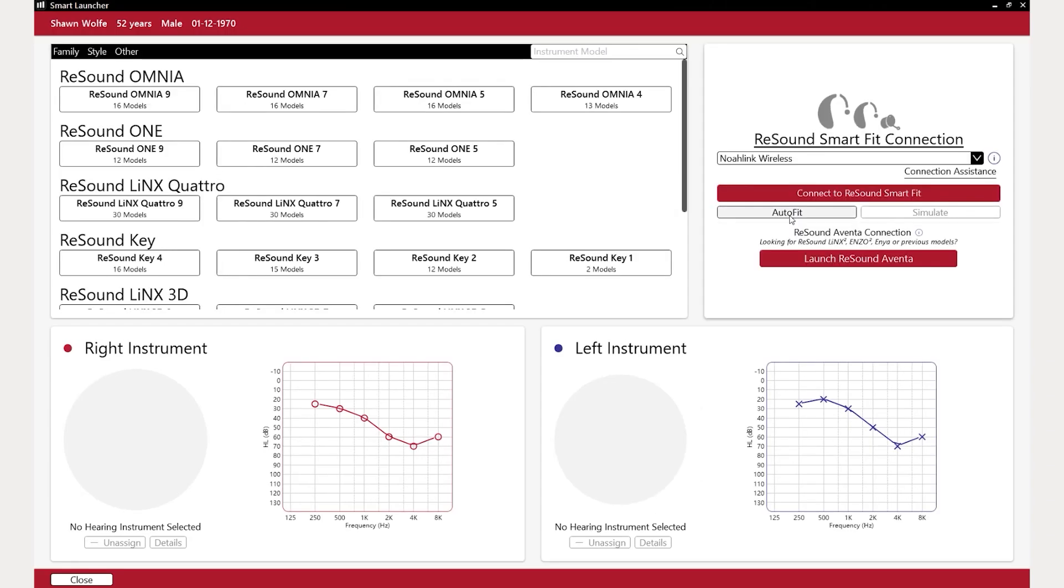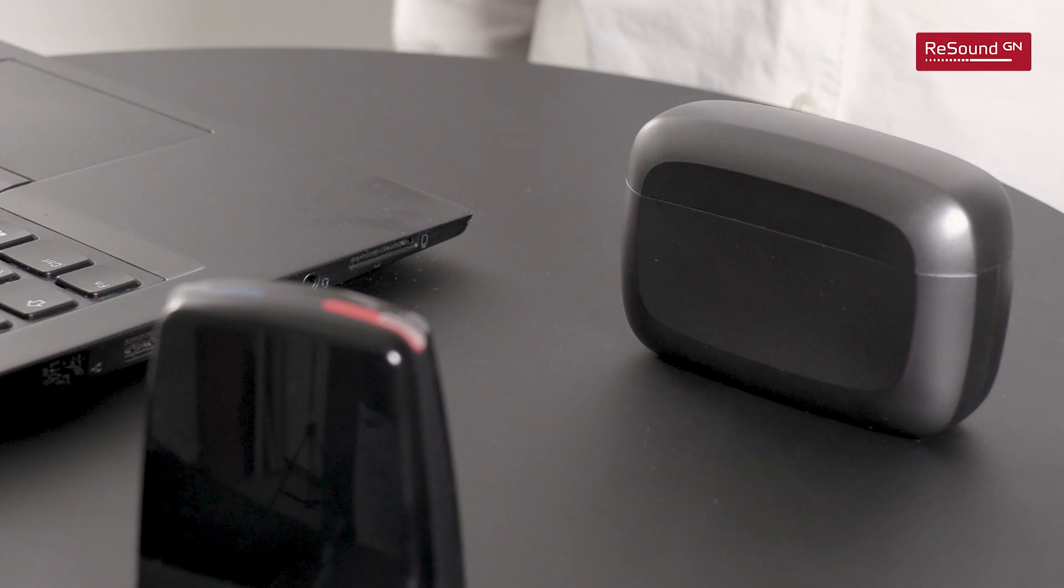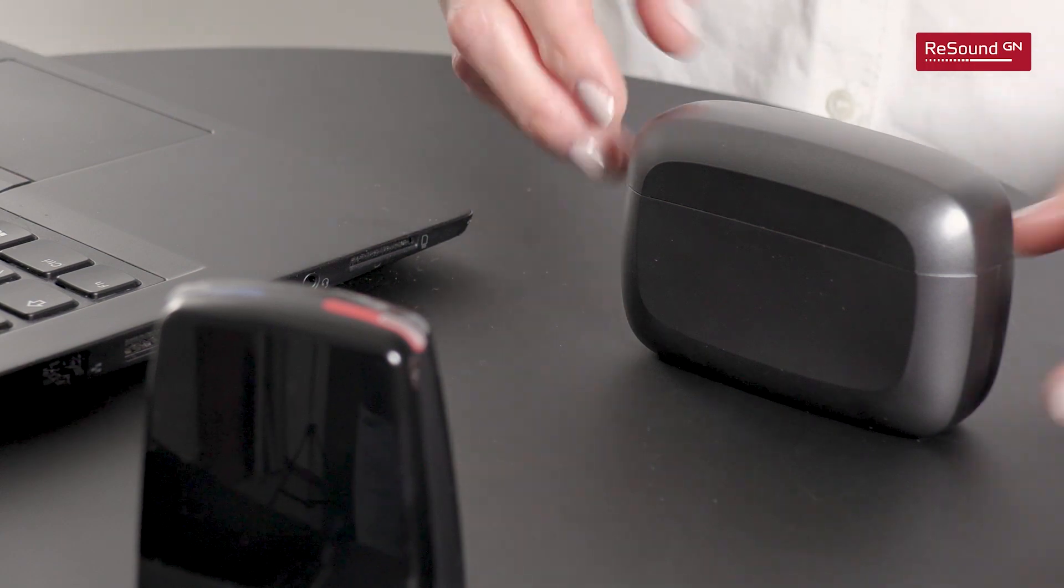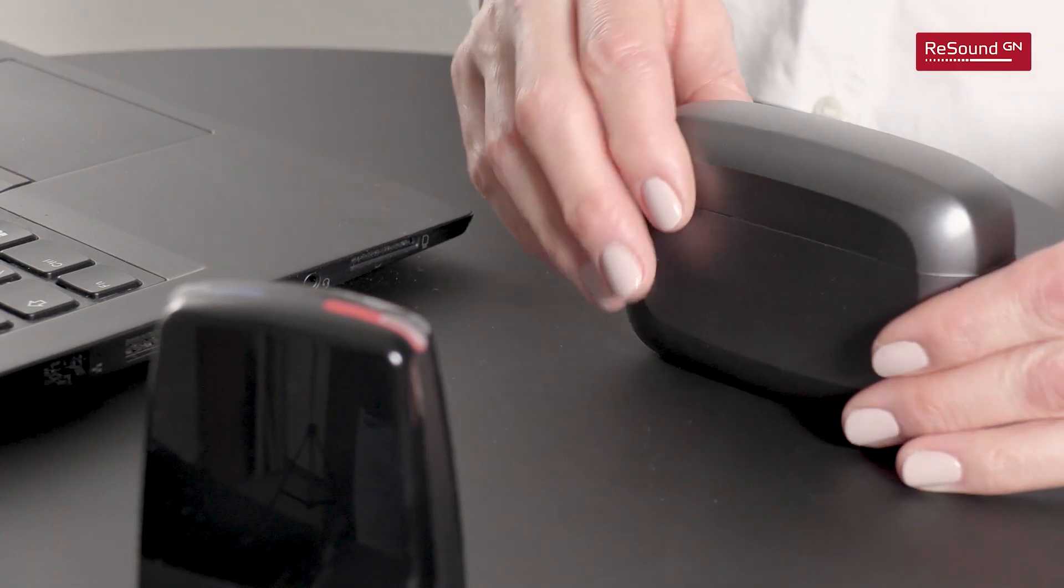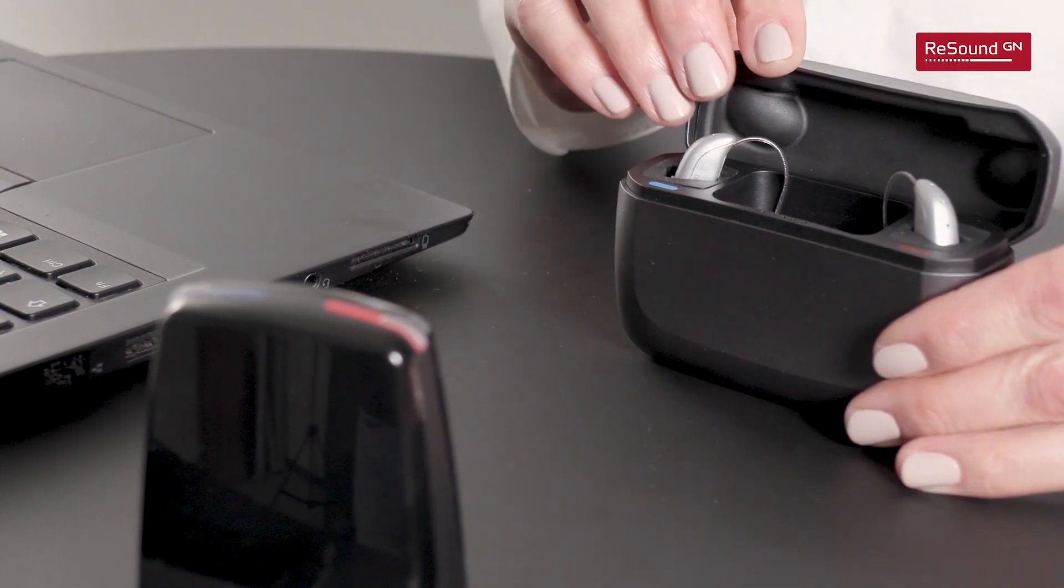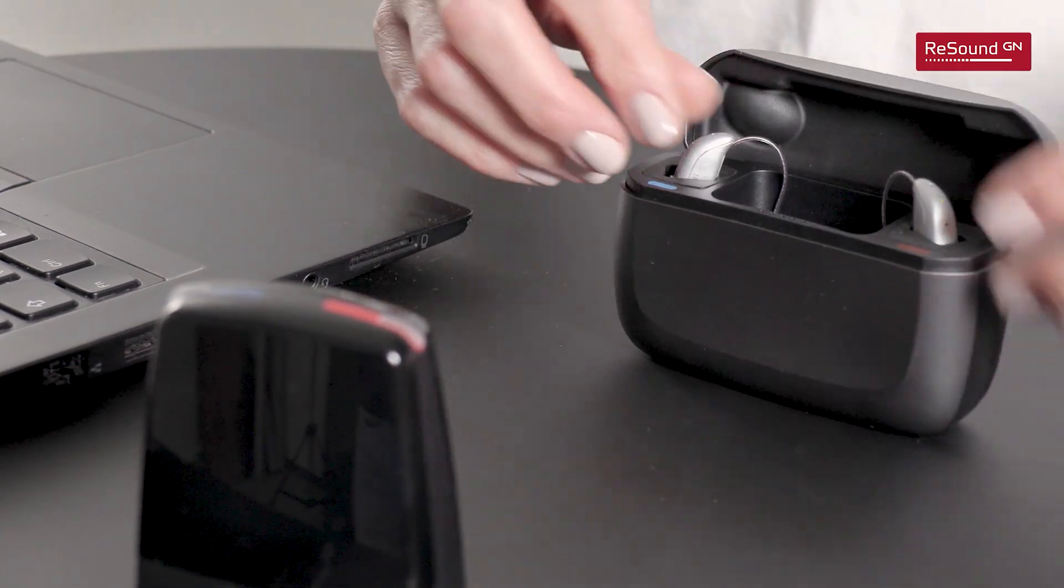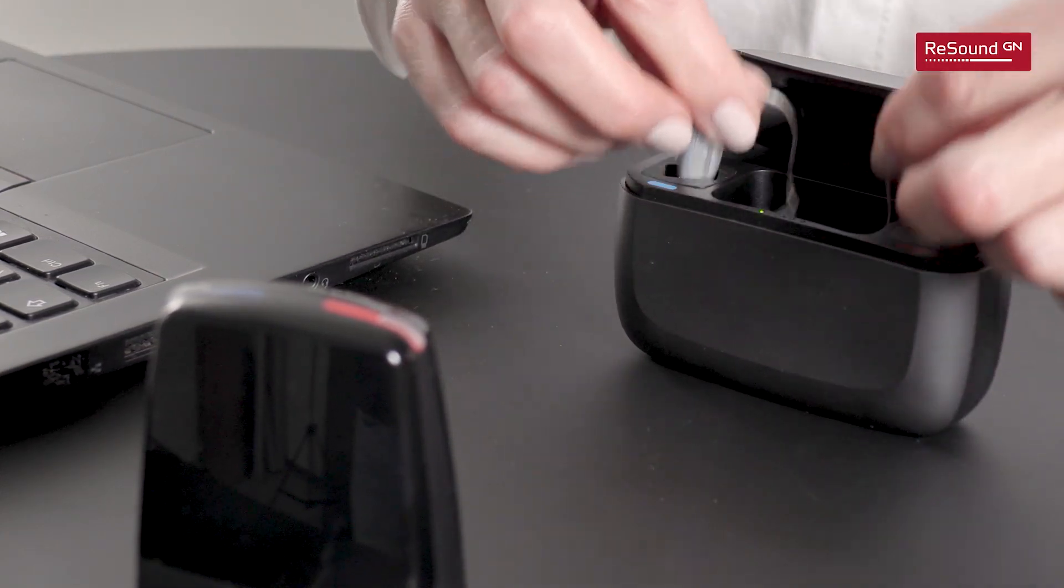Make sure the NOAA-Link wireless is selected and connected to the PC. Click connect to ReSound SmartFit. Remove the hearing aids from the charger and place them in front of you.